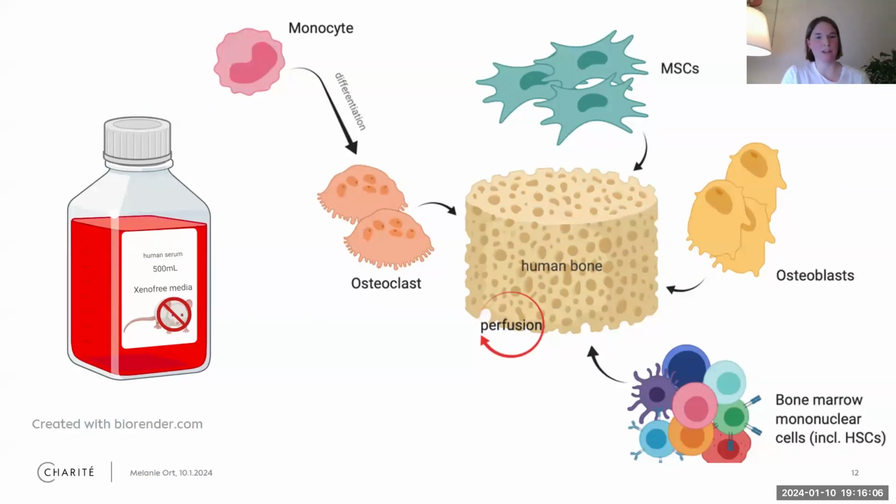It really depends on what research questions you have, but when you start a project, you basically just mix media and see what works, because sometimes too much glucose causes one cell to thrive and the other one just dies. But in general, here again, I introduced all of them to you before.